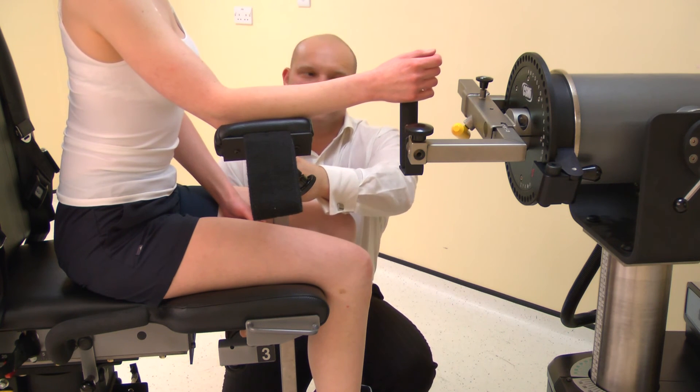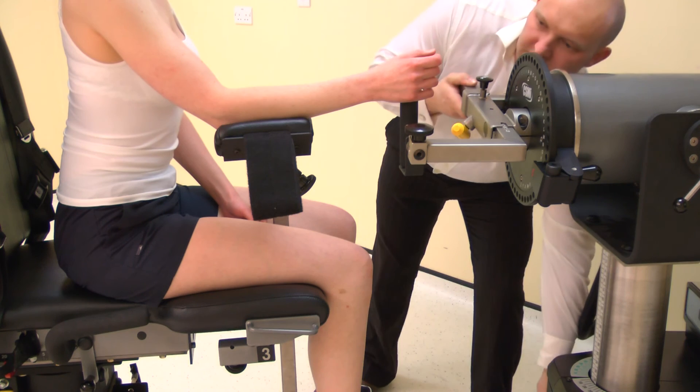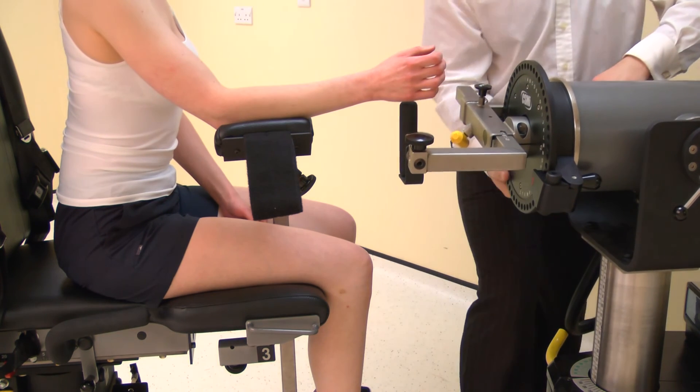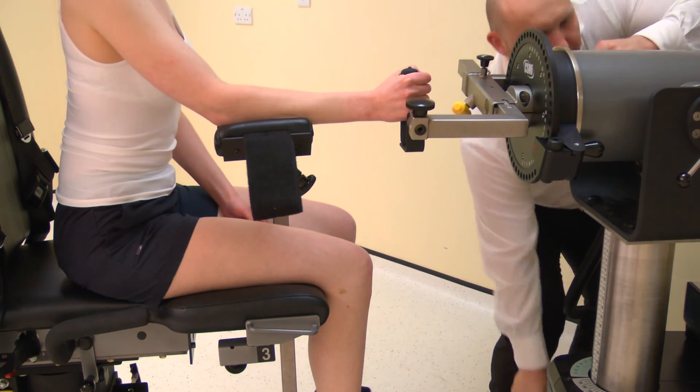Top tip: 90 degrees is the desired angle for the elbow. The chair fore-aft and/or monorail may need adjustment to achieve this position.